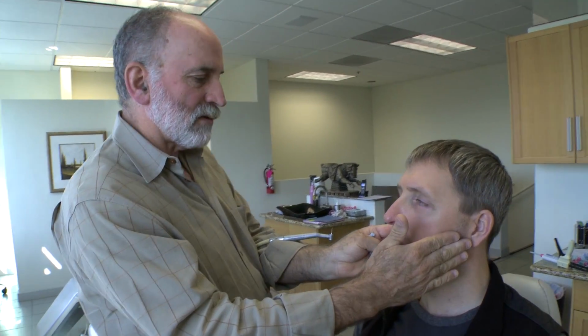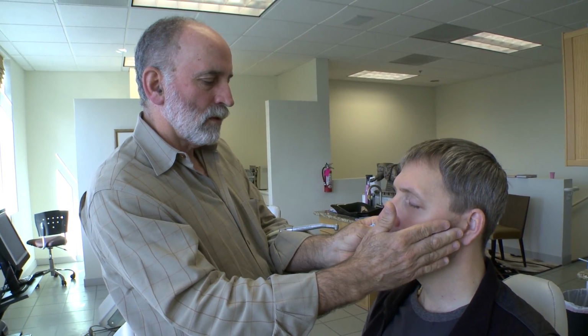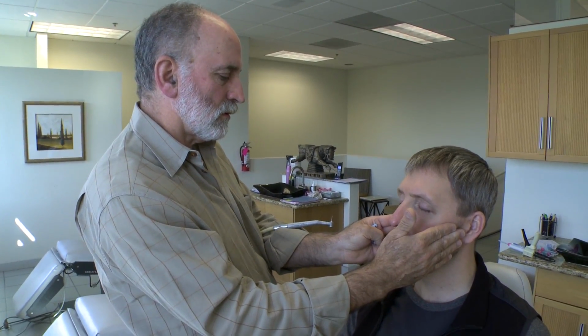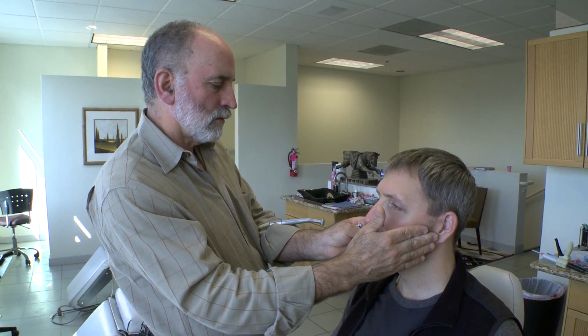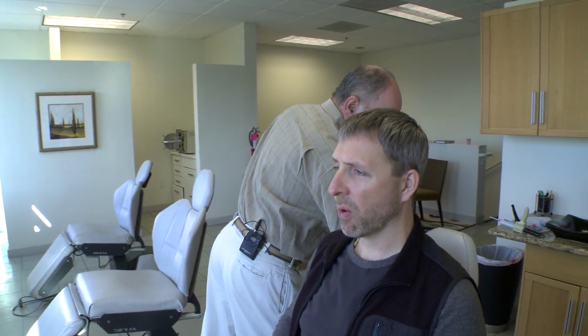The other way you can check these is feel your masseters. Masseters fire at first tooth contact. So slowly clench on those. So pretty good. But this is a pretty sensitive EMG machine as to whether those surface EMGs are jumping equally or simultaneously.